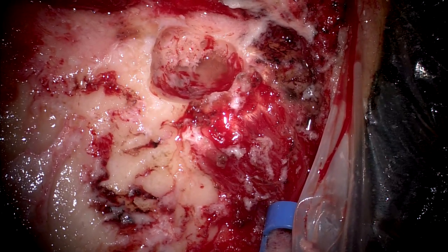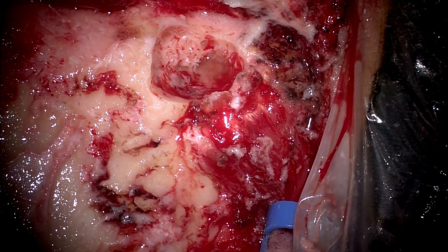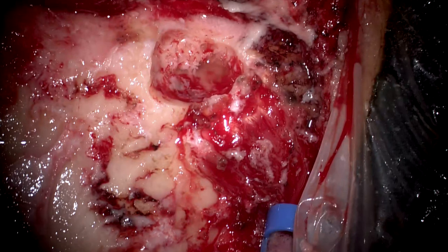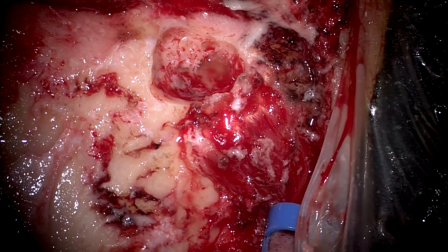Presently, it is done by our beloved Dr. Shayon Hajra. He has started the cortical mastoidectomy part. Then Dr. Jain will be taking over. The flap has been raised and now the cortical mastoidectomy is being done. Please be seated. Dr. Jain will soon be taking over.